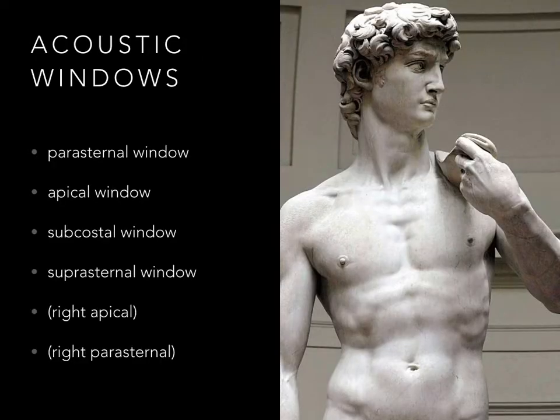The heart is hidden behind bony structures and it's covered by air-containing lung tissue. Recall from the basic physics lecture that ultrasound is almost completely reflected on air soft tissue interface as well as on bone soft tissue interfaces. We need acoustic windows to develop a series of standardized views of the heart.